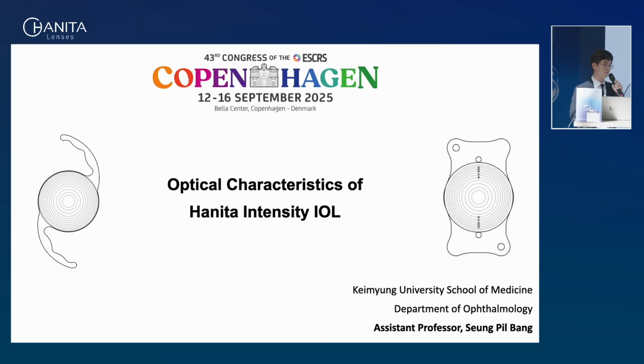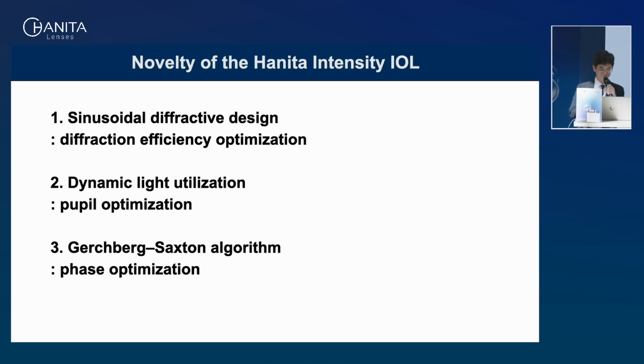My name is Seung Pil Bang from South Korea, and I'm a clinician ophthalmologist and also a vision scientist who is working on testing these IOLs and researching how they work. So today I'm going to talk about the optical characteristics of the Hanita Intensity IOL, which is kind of an optical secret because it's a really interesting design. So let's move on.